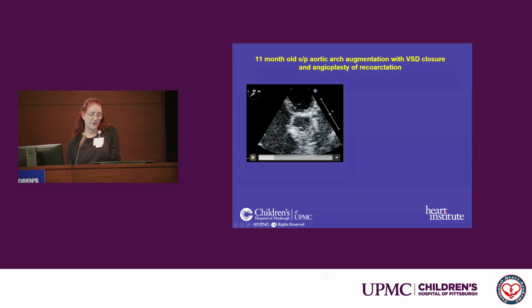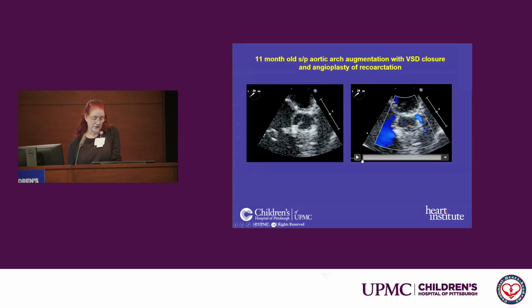Just to verify, we had actually suspected this on the newborn echo, but this child has a tri-leaflet aortic valve. And the leaflets themselves look okay. Again, the annular size is hypoplastic. And despite all of this that's been going on, there was just trivial central aortic insufficiency.